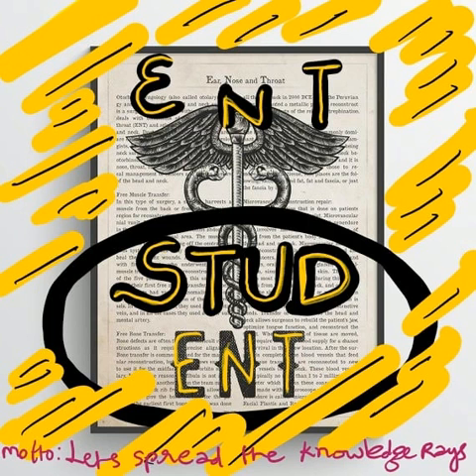Mastoid tip is identified inferiorly. And linea temporalis is a ridge of bone extending from the superior border of the zygomatic arch posteriorly onto the mastoid cortex. It is the inferior limit of the temporalis muscle, and it marks the middle cranial fossa dural plate.